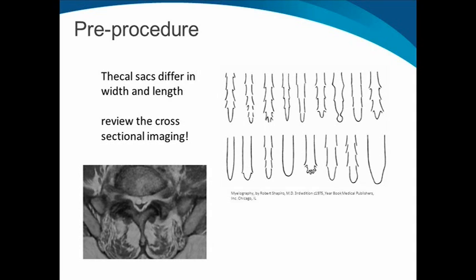I personally have done over 1,000 myelograms at the L5-S1 level with very good success, and specifically it produces an essentially painless procedure. The theory that I have behind this is that there are fewer nerves lower down in the thecal sac and therefore fewer nerves to be irritated by the procedure. However, the one caveat is that we do have to have cross-sectional imaging available to us prior to the procedure, either a CT scan or an MRI that the patient is asked to bring with them so that we can review the size of the thecal sac at the L5-S1 level prior to puncture.